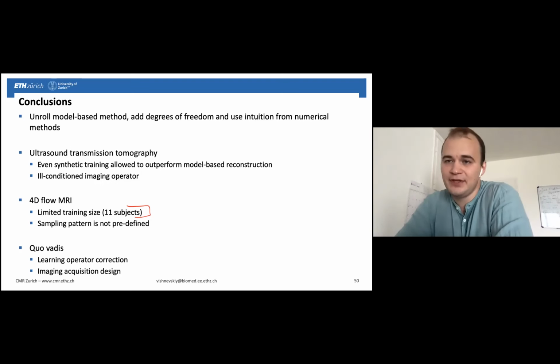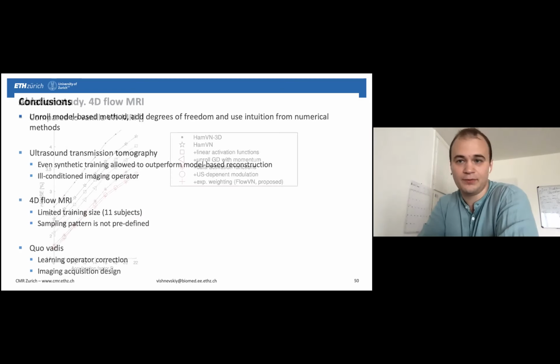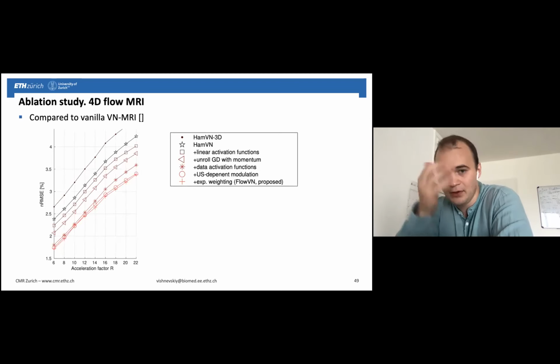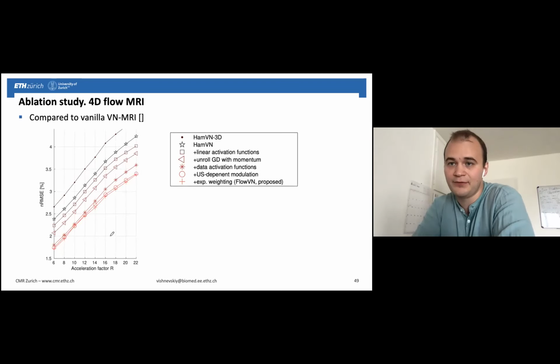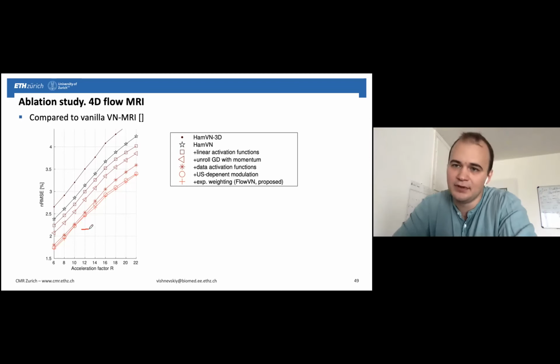But reasonably, for 4D flow MRI we have a lot of data, right? So a 4D data tensor. Here we report results for acceleration factors of up to 22, and some other people also report up to a factor of 22, but the prospective study that we had was at an acceleration factor of 12. So I think that 12 or 15 is, for now, the reasonable expected acceleration rate for multidimensional data.